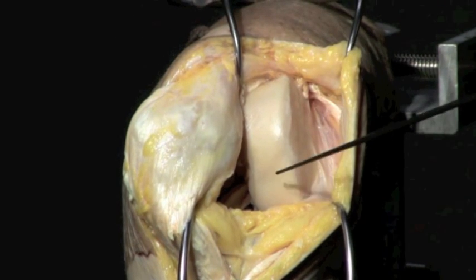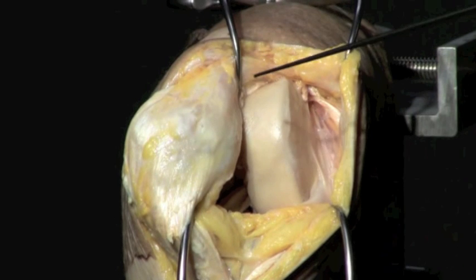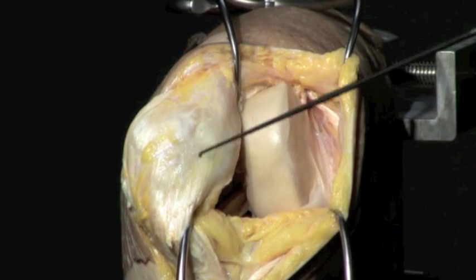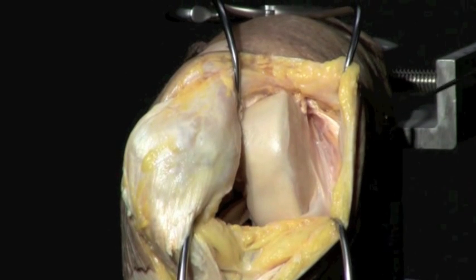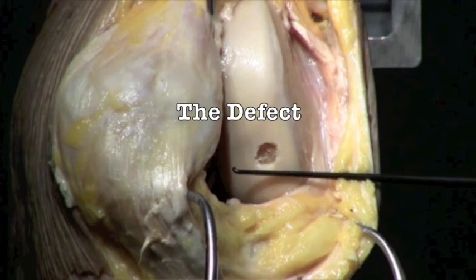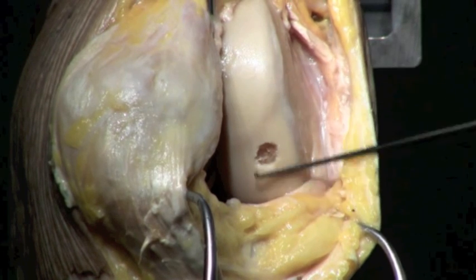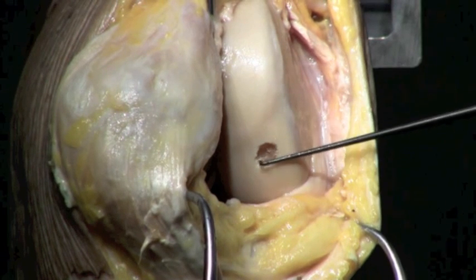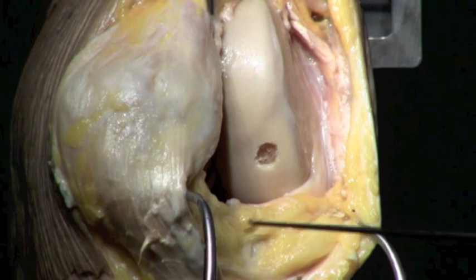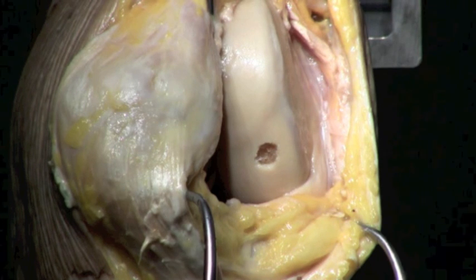Shortly, I'm going to make a little defect that simulates a defect that a patient might have after injuring the knee in some type of sporting injury or other type of injury. And then I'll show you a couple different ways of repairing that. Here's a defect that we made on this, which is now the lateral femoral condyle. So here's a little defect that I made. Let's pretend he had a really good soccer game, scored a few goals, but this was the consequence. So we'll see how we can replace that.